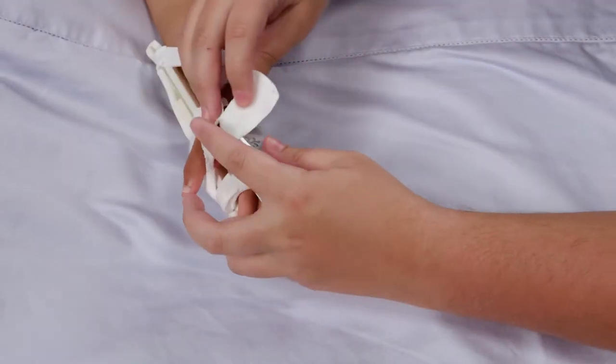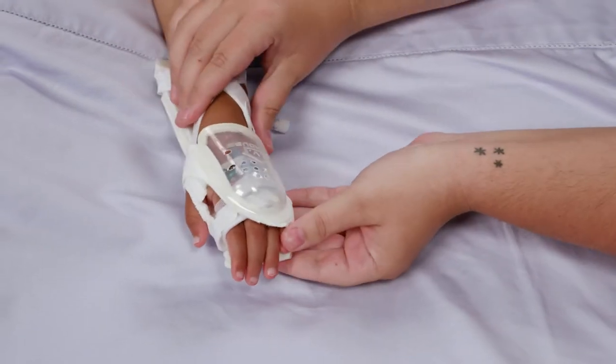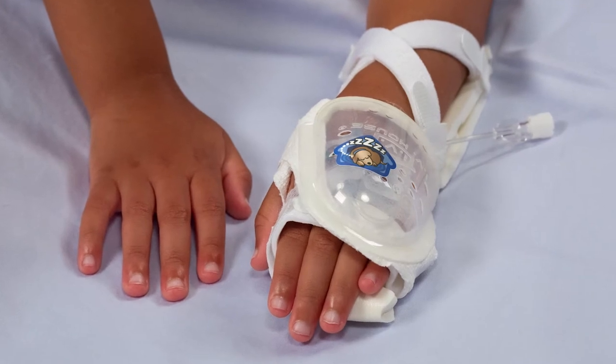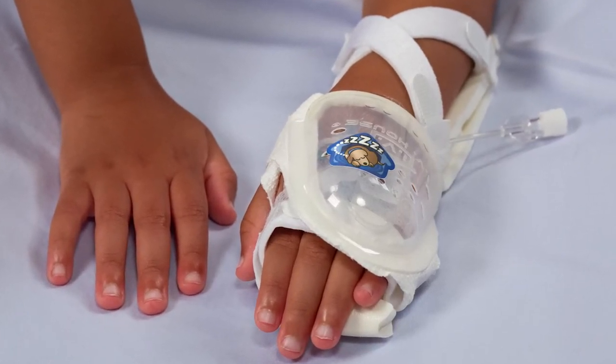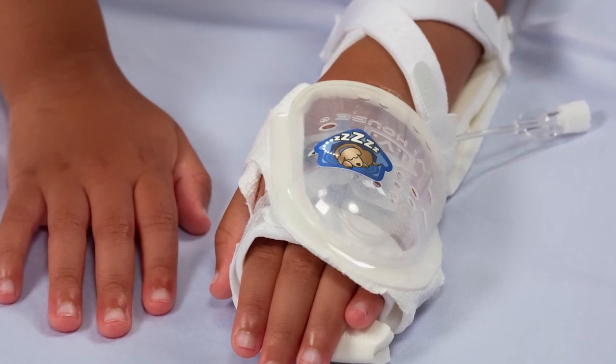Wrap the fabric snugly around the palm of the hand and secure with Velcro. Allow tubing to exit from the open end of the dome. Remove the crack-and-peel backing from the puppy sticker and apply the sticker to the dome.